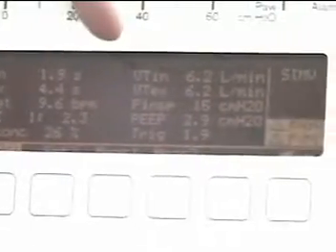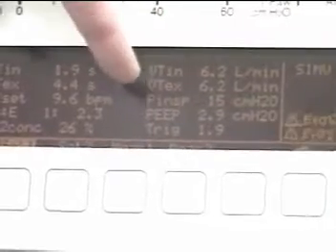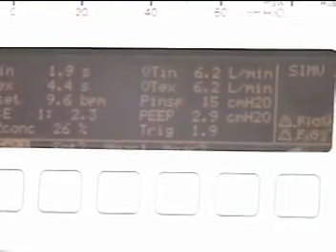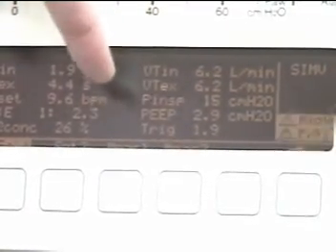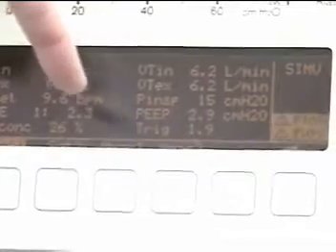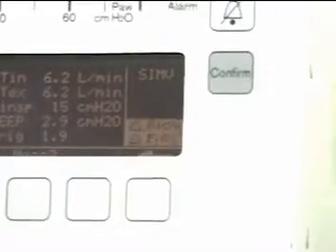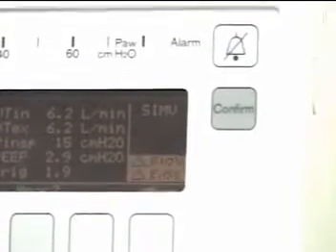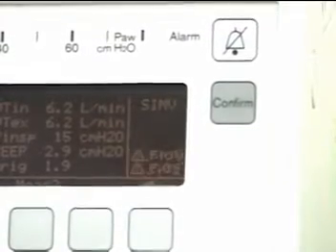You'll see the volume of gas that's being inspired and then expired, the pressure on inspiration, the PEEP, and the trigger value. Off to the far right is the mode that you're in, and in this case we are in the SIMV mode.